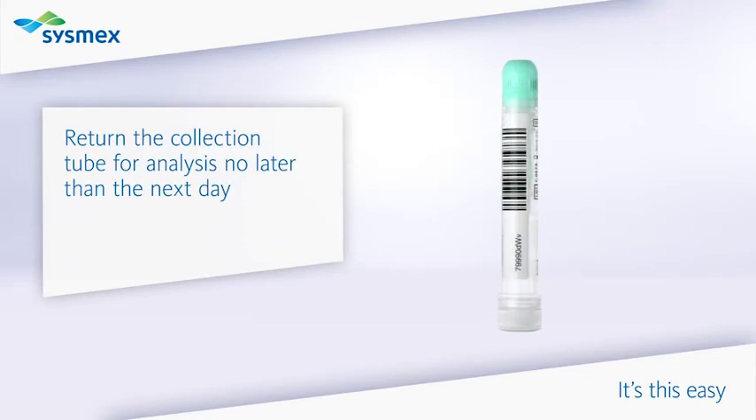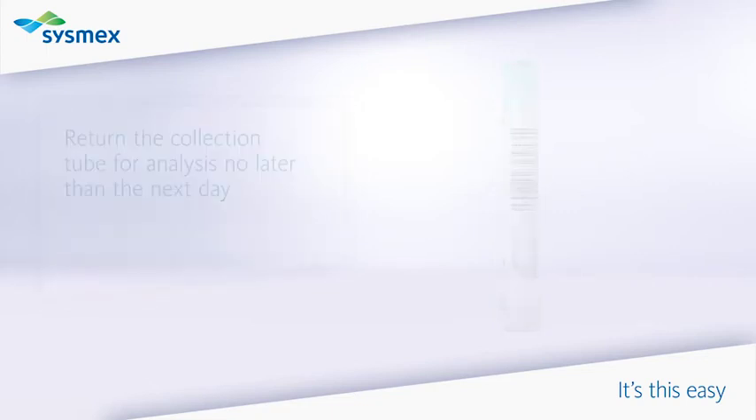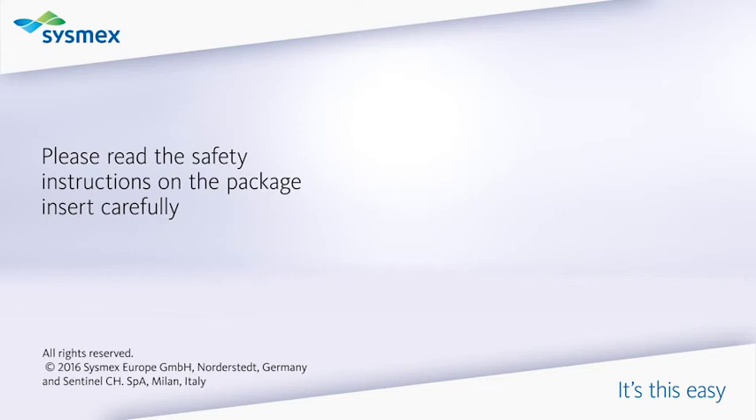Return the collection tube for analysis no later than the next day. Please read the safety instructions on the package insert carefully.